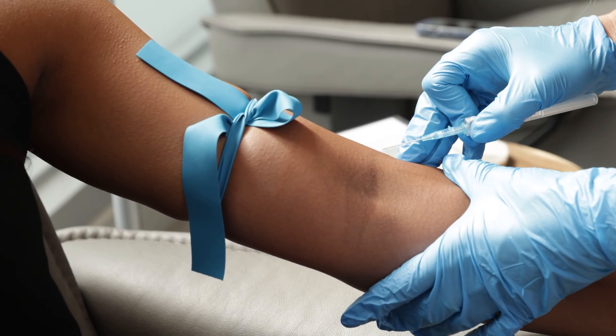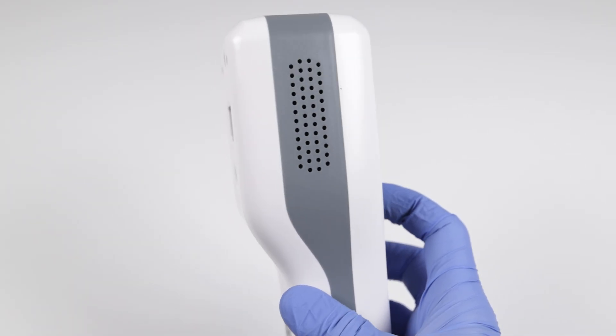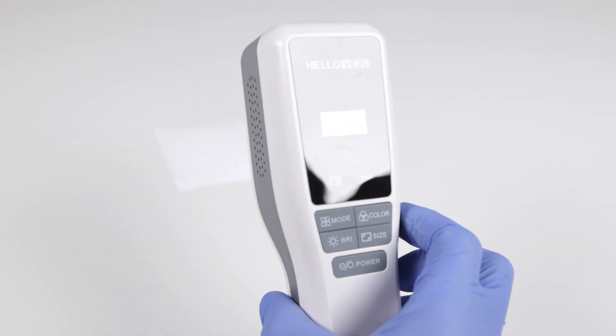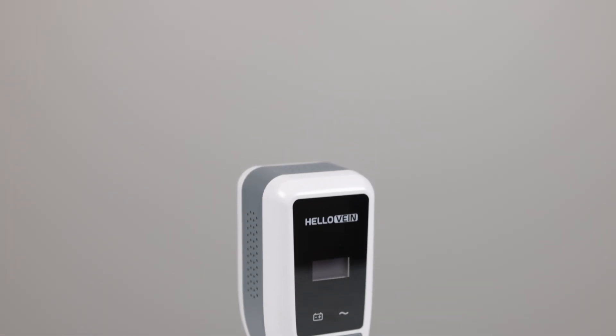This alone will not make you better at starting IVs or phlebotomy — it's just another tool to be used in conjunction with your other resources. That's the quick review of the HelloVein 2.0 Lite. All this information is provided by HelloVein and is available on their website and through their instruction manual.